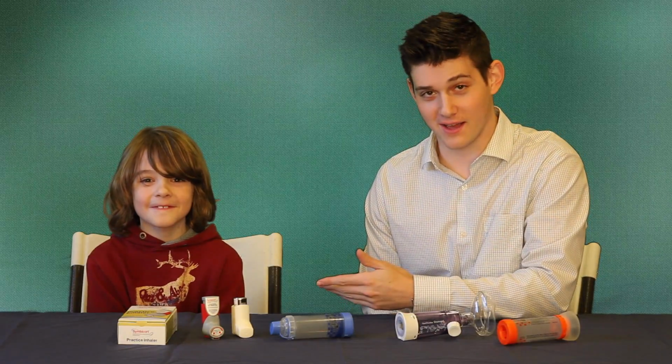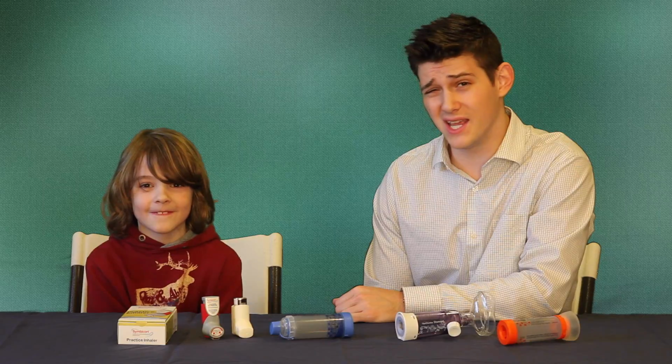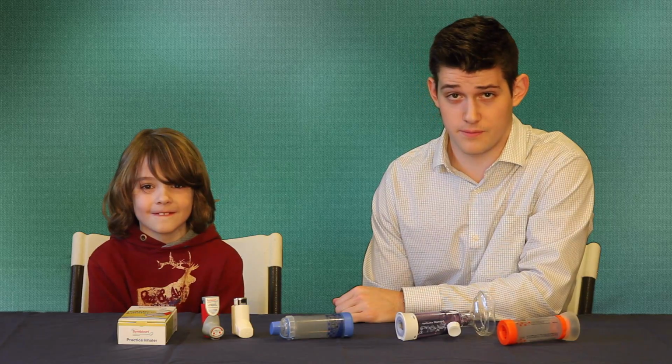This is our patient X. His name is actually X. Let's pretend X was just prescribed his first inhaler and spacer, and he needs to learn how to use them. As we go through the procedure, we'll highlight steps that have been found to be the most error-prone.